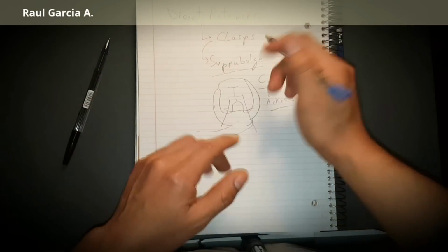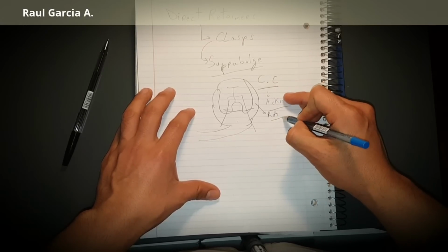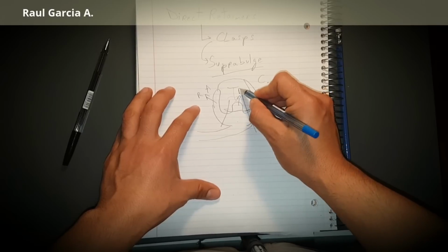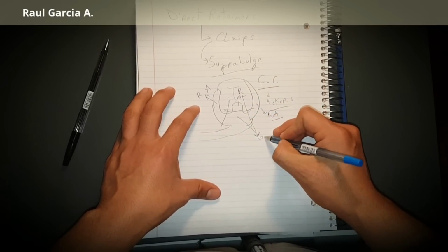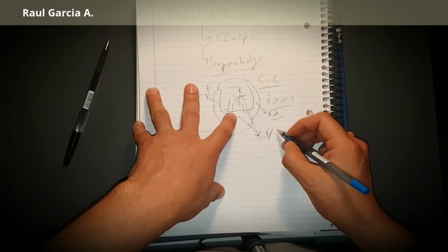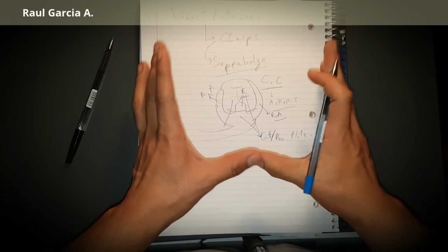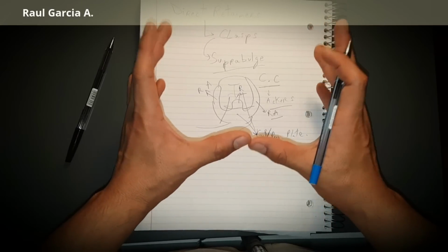So what does it mean? This is the retentive arm. We should have a retentive arm, and we should have a reciprocal arm. We should have a rest, an occlusal rest, and here is included the guiding plane. Guiding plane, or its synonym, proximal plate. So this is the basic one, okay? That is the purpose.